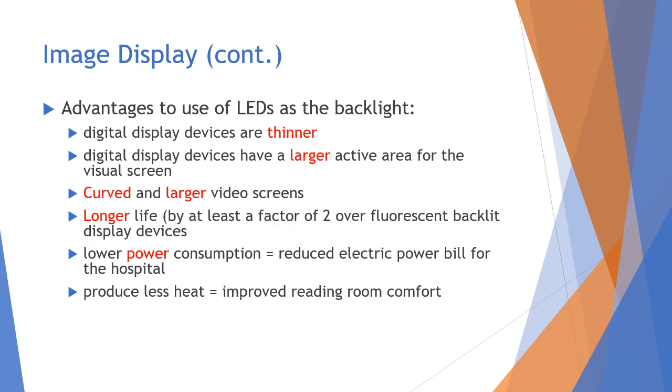The advantages to using an LED as the backlight are that digital display devices are thinner. Digital display devices have a larger active area for the visual screen. They can be curved and they're larger video screens. They have a longer life by at least a factor of 2 over the fluorescent backlit display devices. They have lower power consumption, a reduced electric bill for the hospital, and produce less heat, so improving reading room comfort.